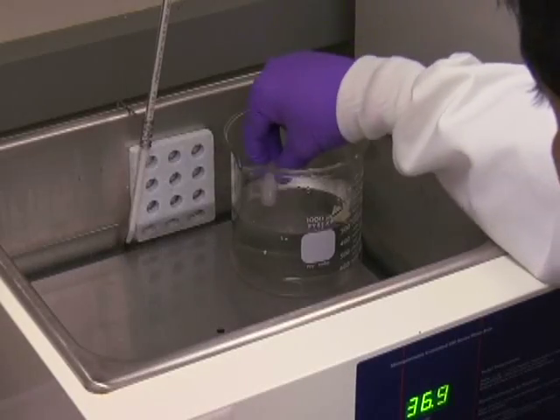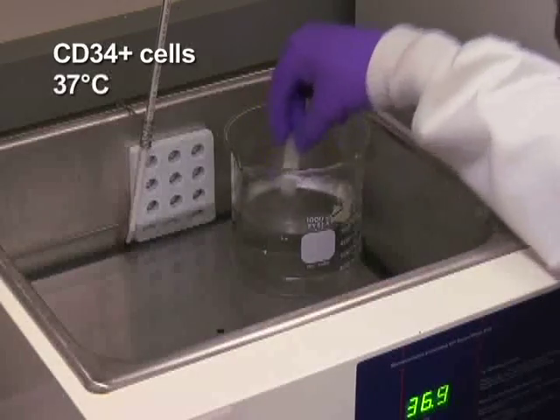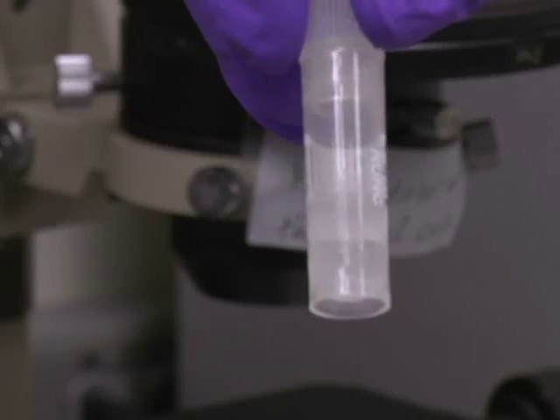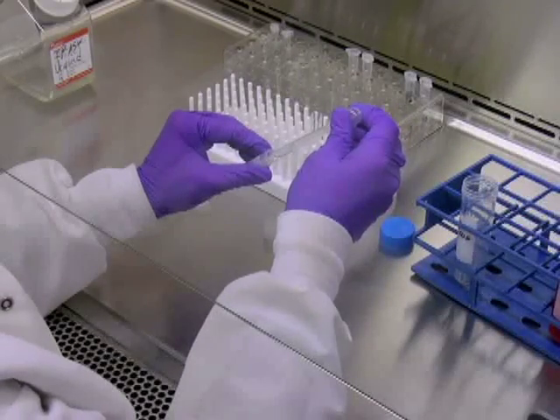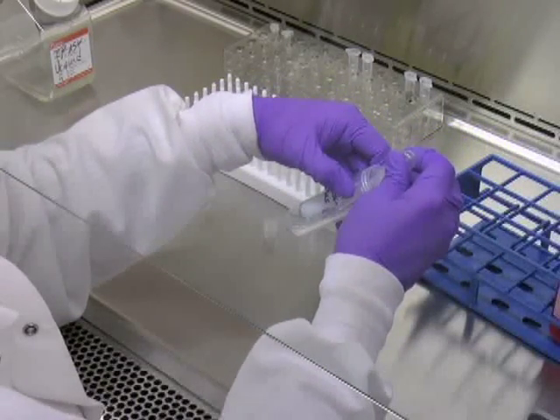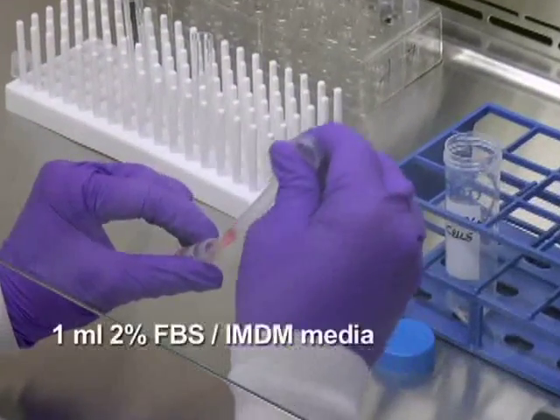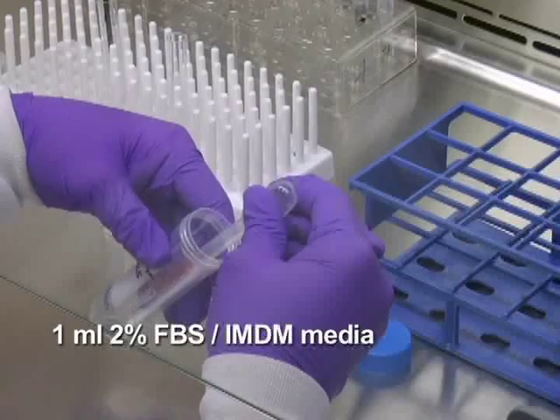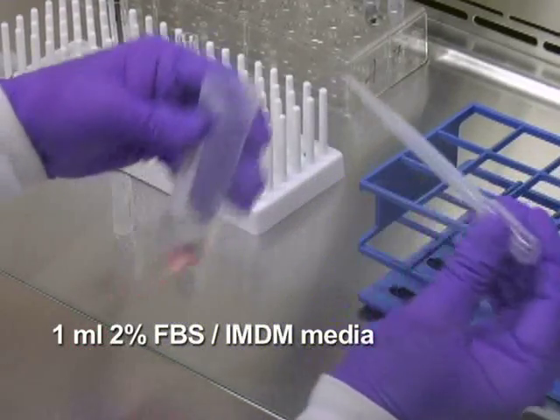In order to seed a culture, quickly thaw a vial of frozen CD34-positive cells at 37 degrees Celsius by gently shaking until a last small ice crystal is left, and transfer the cell suspension to a 50-milliliter conical tube. Gently rinse off the remaining cells from the vial with 1 milliliter of room temperature 2% FBS IMDM media and add it dropwise to the 50-milliliter tube while swirling gently. Now wait for 3 minutes.